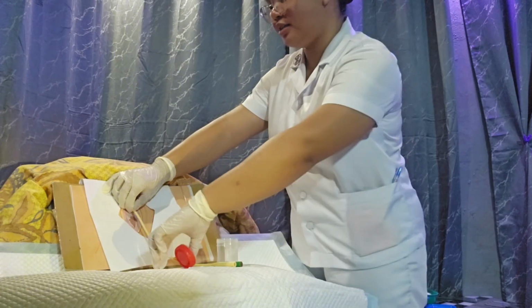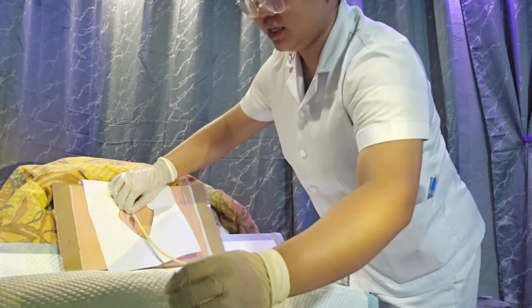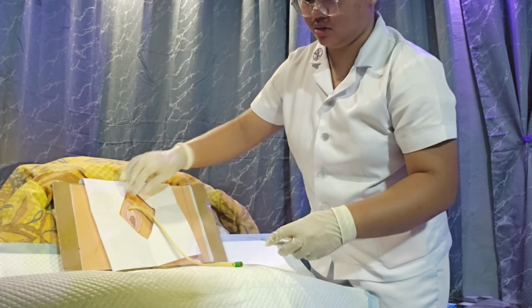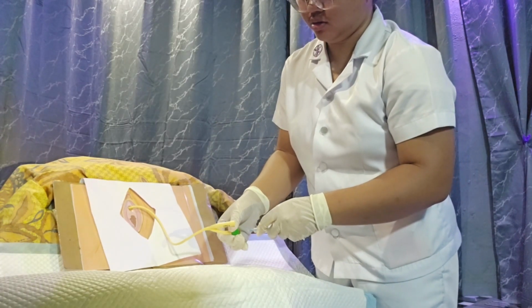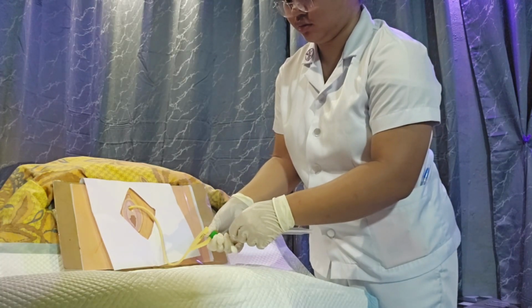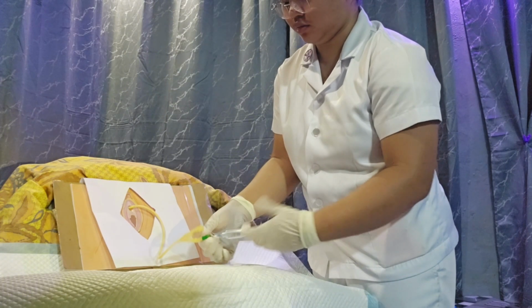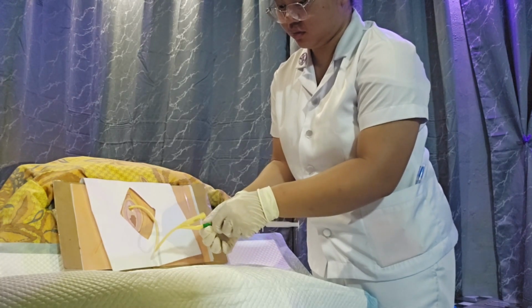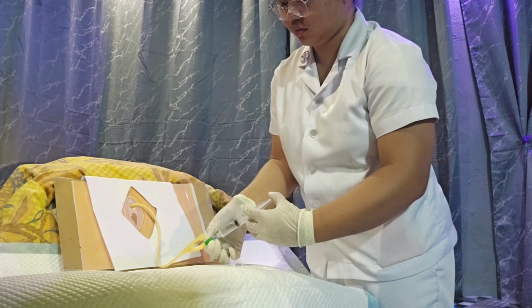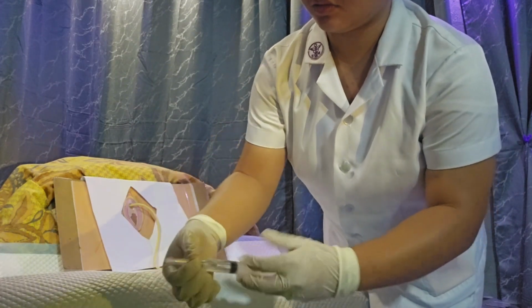So after getting a urine sample, we are now going to hold the catheter in place with our non-dominant hand and then inflate the patient's catheter balloon.